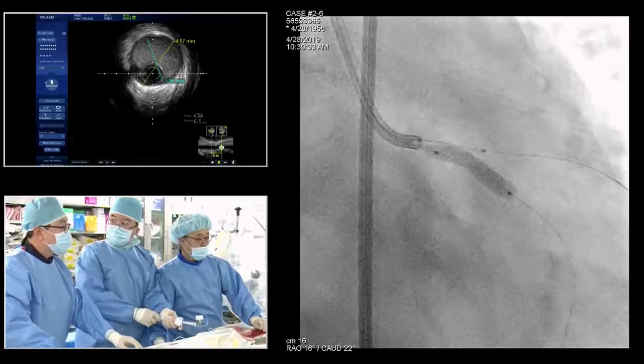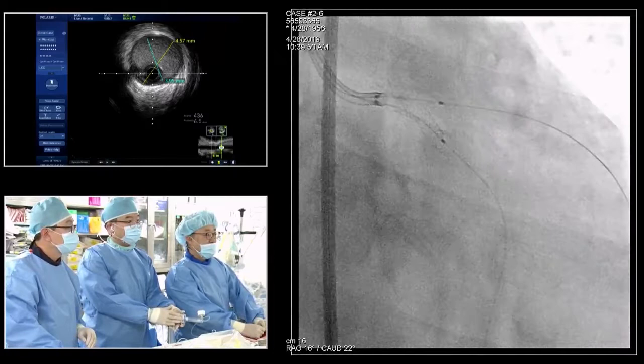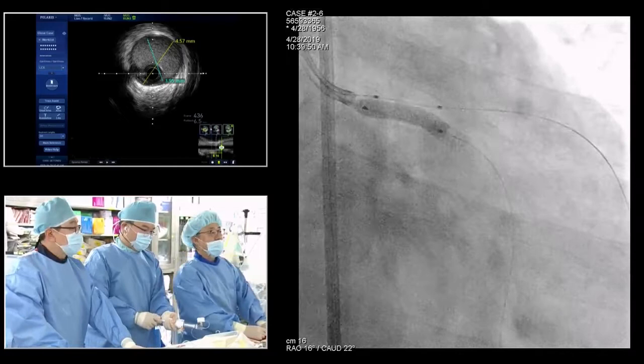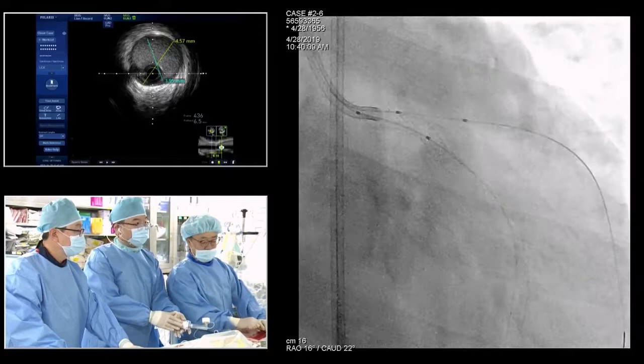Okay, deflate. This is 4.0/16 and Synergy, slightly pull back. Okay, one more, go. 6, 8, 10, 12, 4.1, 14, 4.2. Okay, deflate. And then we're going to remove the stent balloon and wire from your side, right? Yes, that's right.